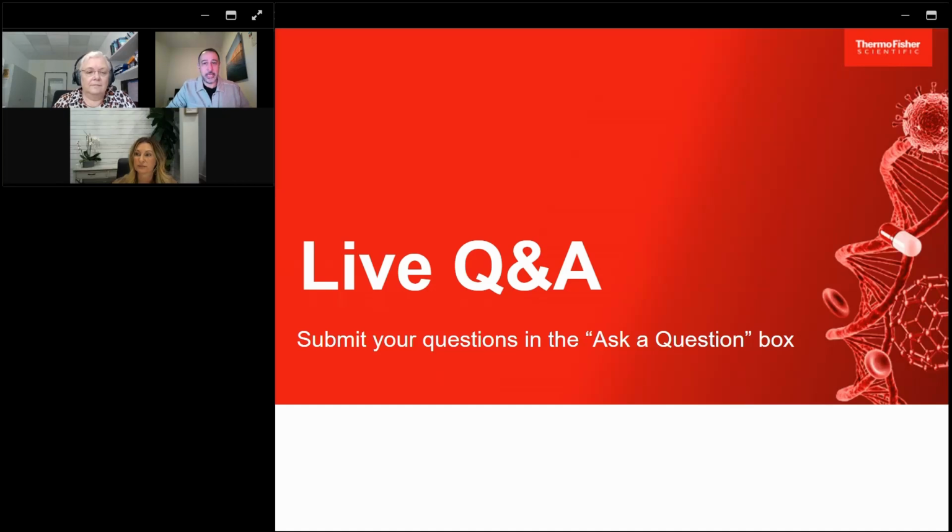Very good question, and the answer is no. The type of technology in APAS is very early machine learning, and there's a lot of good application for CNNs in different problems, but for our particular problem in microbiology and bugs growing on plates, the very early machine learning systems do the job. So as we look at APAS 2.0 and 3.0, we would look to move to CNNs or other AI where we see a need to do that.